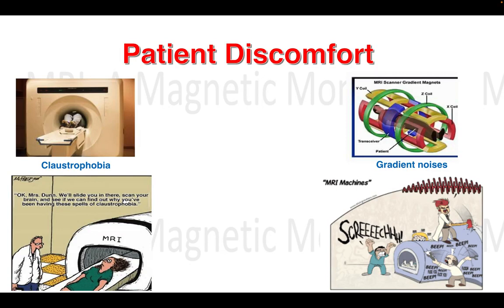All right, so disadvantages. I'm sure everyone has heard of the knocking noises and closed-in, claustrophobic feelings. Starting with claustrophobia, it can cause the patient to decline MRI imaging, and the confining nature of the MRI apparatus can lead to the patient feeling closed in during their MRI. And sometimes talking to friends who had prior experience with MRI could scare the patients as well.